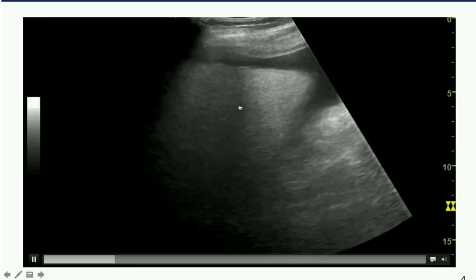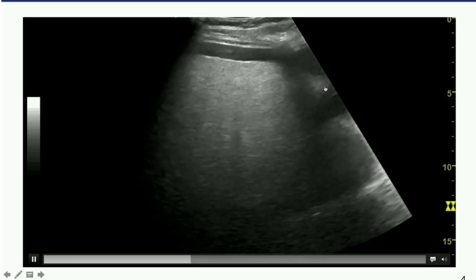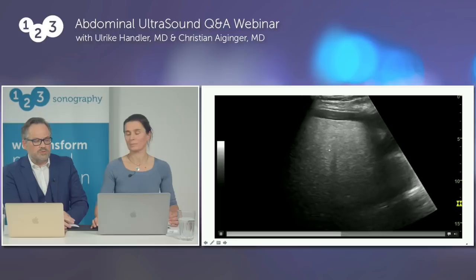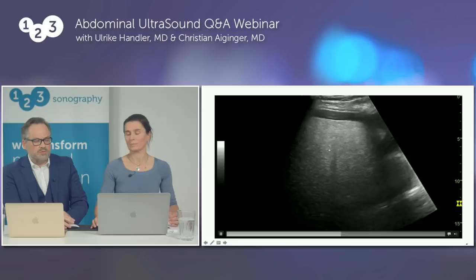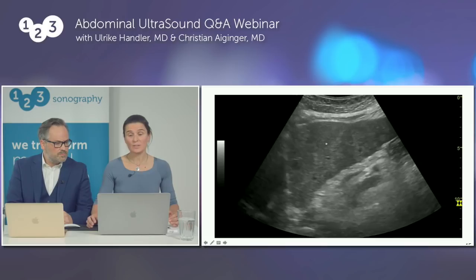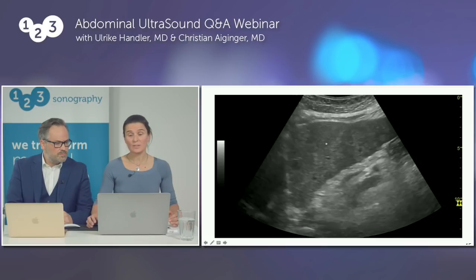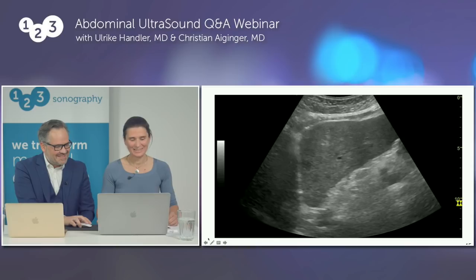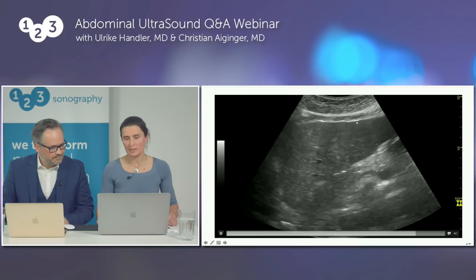In the far field, there is increased attenuation — you cannot depict every liver segment because of the increased attenuation of ultrasound beams in liver cirrhosis. Here's another example of liver cirrhosis without ascites. Looking closely at the capsular contour, especially at the caudal rim, it's not smooth anymore. Follow both the cranial and caudal rim of the liver to check if the capsular contour is smooth.